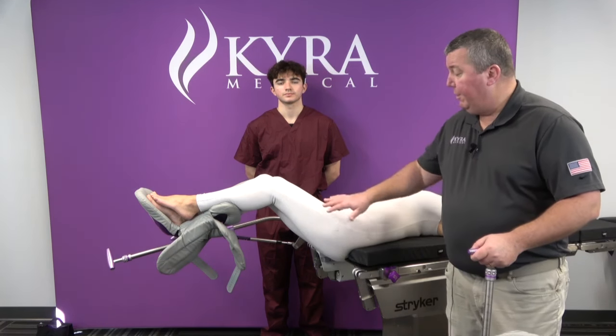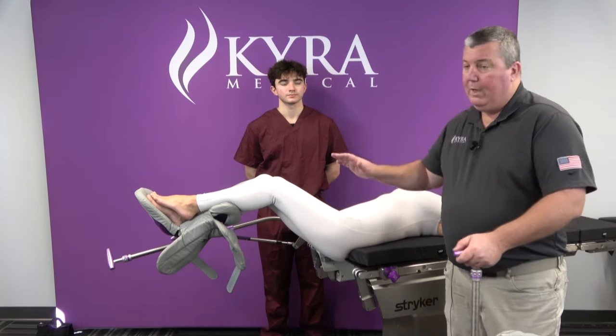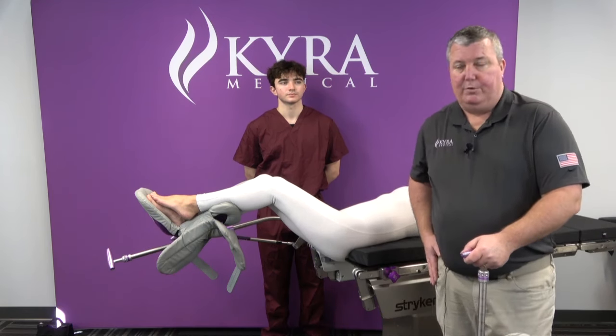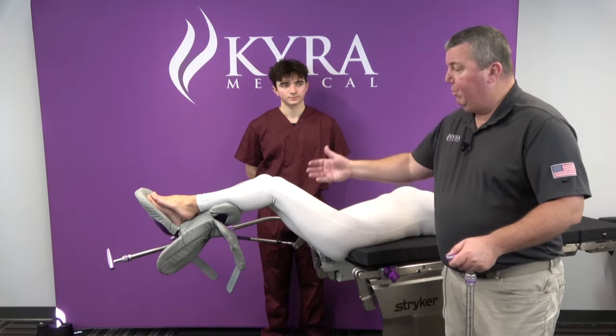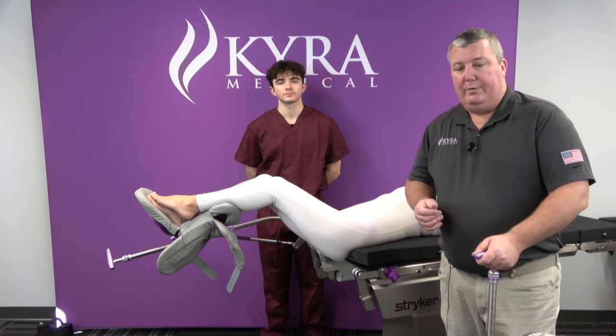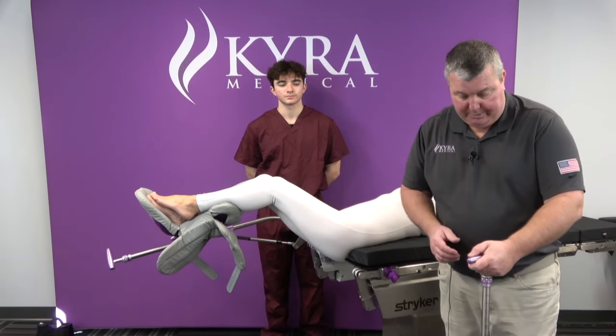The reason we do that is because we don't want to move one leg and load up all that pressure on the hips, because you could have a hip dislocation. So it's very important — two people moving the legs at the same time as a mirror image. This is something to practice, and I'll try and share some tips as the video goes along.